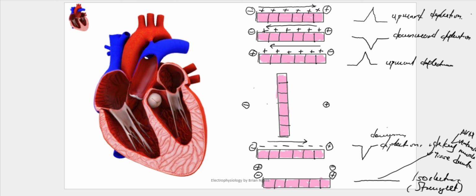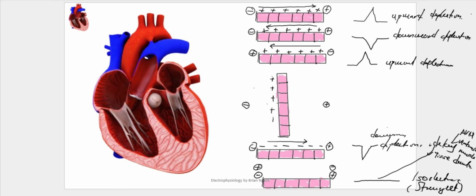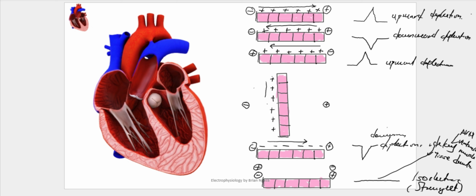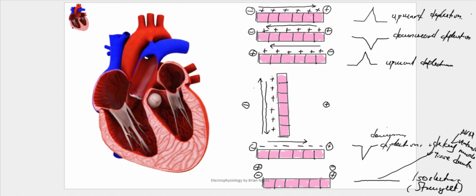And let's assume again we are having a wave of depolarization spreading in this particular manner. So here we'll create 4 scenarios at a go. The wave of depolarization could be descending, or it could be ascending. We just want to understand how that will be translated into an ECG machine.